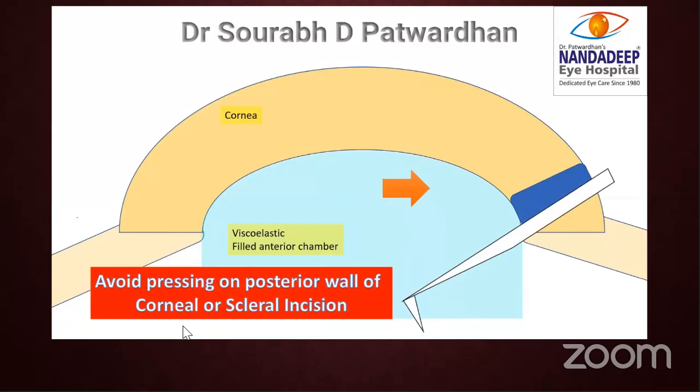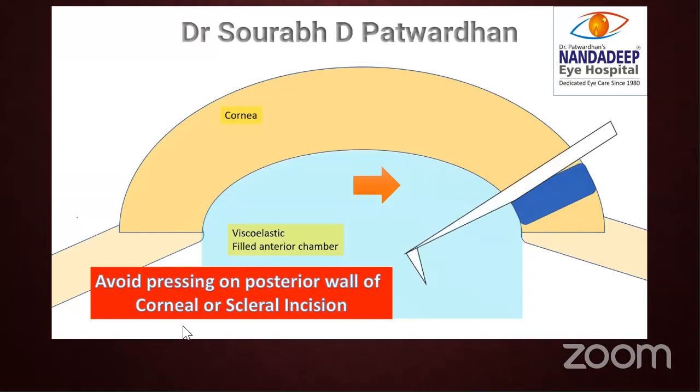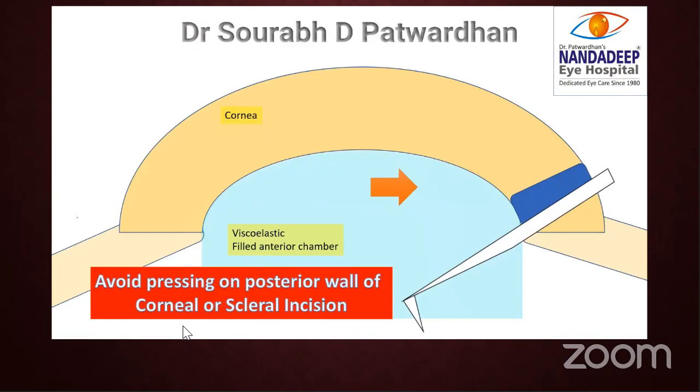So during CCC, you have to see to it that there is never posterior movement of your instrument. The posterior lip should never be pressed. So most of the forceps, except the micro Capsulorhexis forceps, you have to use the main incision for doing CCC.